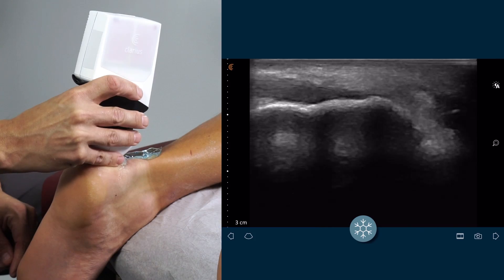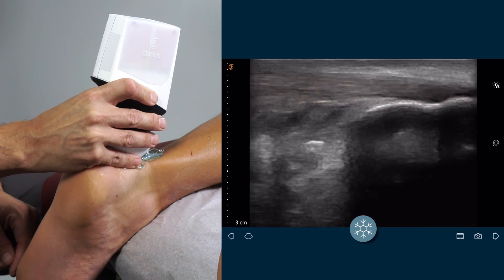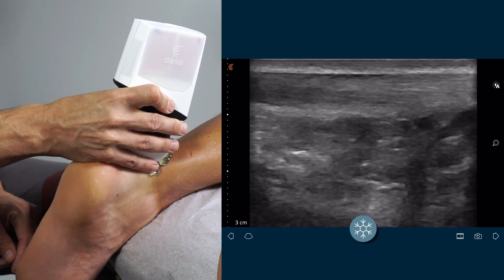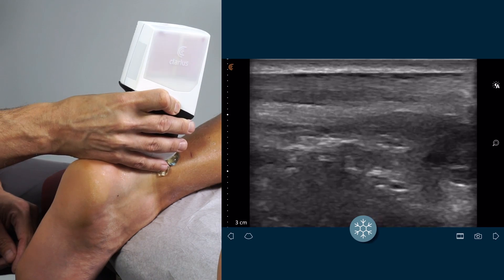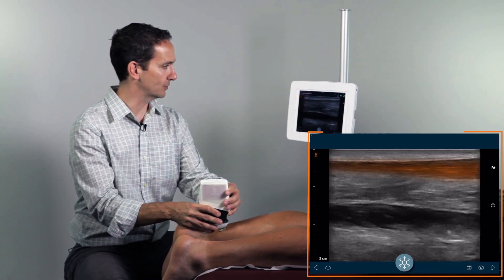Begin with the probe in a longitudinal orientation and identify the insertion of the Achilles at the Calcaneus. Assess the tendon fibers along their long axis to the myotendinous junction.